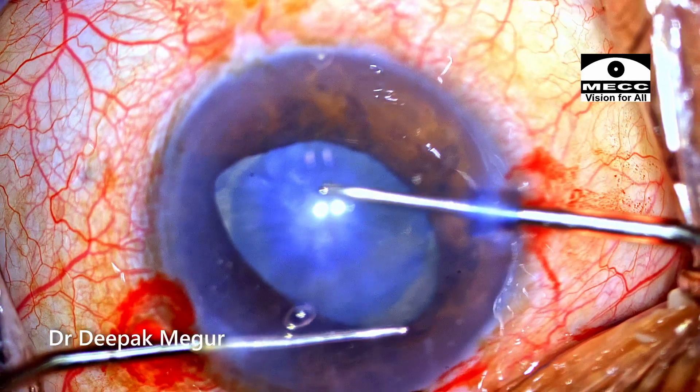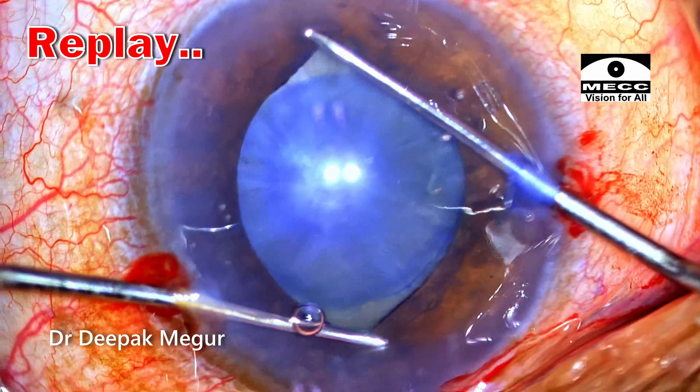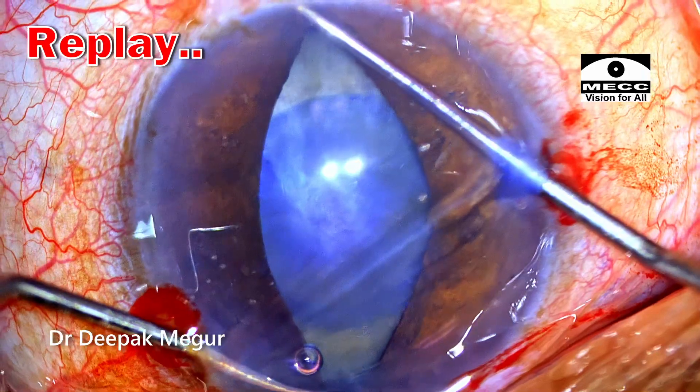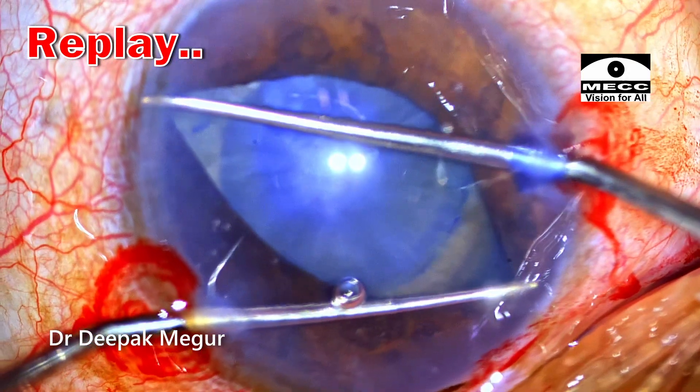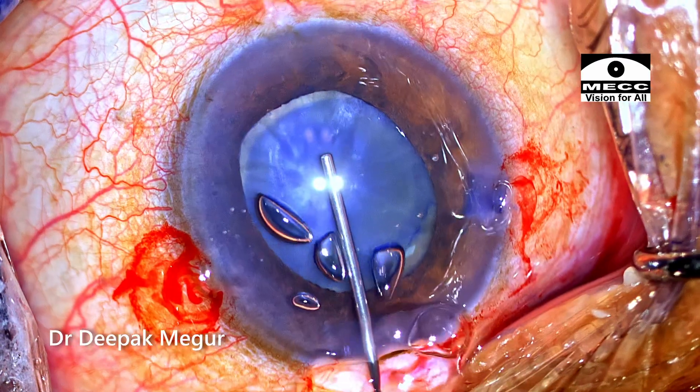We have a challenge here — the lens is very swollen, and there is always a risk of the Y-hook rupturing the anterior capsule. Extreme care has to be taken not to touch the anterior capsule when performing stretch pupilloplasty in this situation.